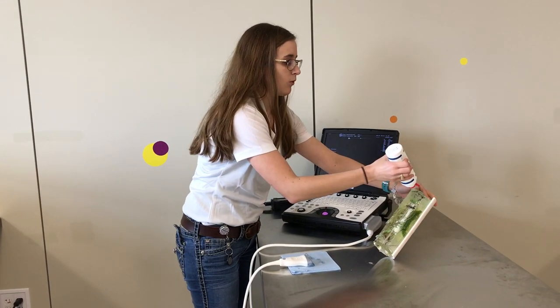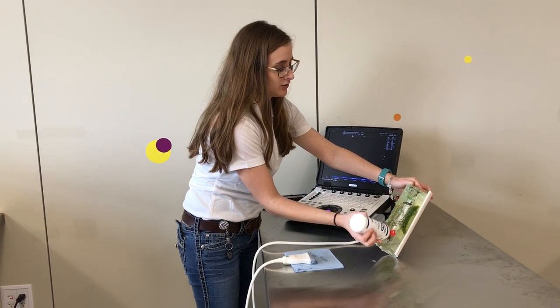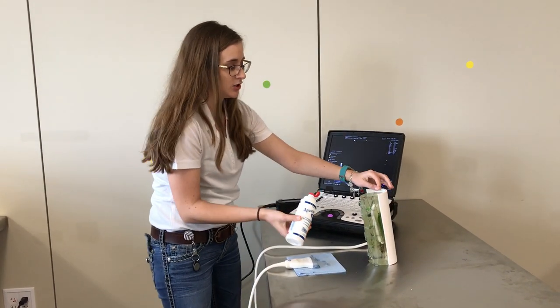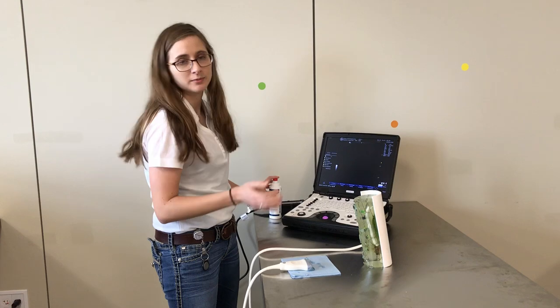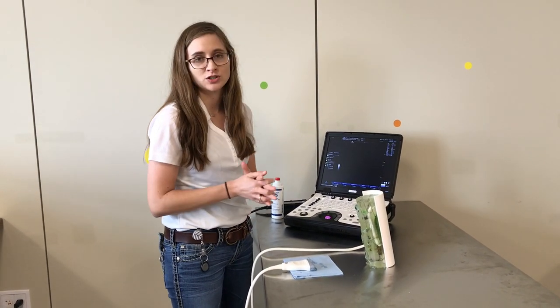You may be wondering, why do I even need to shave the limb? Well, if you leave any hair on the limb, you'll have trapped air bubbles between the hair follicles, and that will be an artifact when you go to ultrasound.